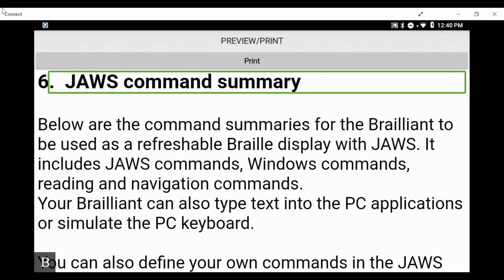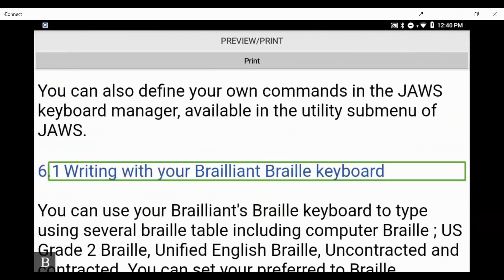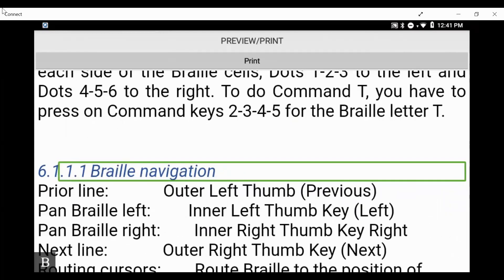You can use dots one through six to move through heading levels one through six. Pressing my next thumb key: 'Below are the command summaries for the Brailliant to be used as a refreshable Braille display with JAWS' — it brings me right to this part of the document. If I want to jump to the next heading, I press H. We hear: 'Six point one, writing with your Brailliant Braille keyboard, heading two.' Press H again: 'Six dot one dot one, basic commands, heading three.'